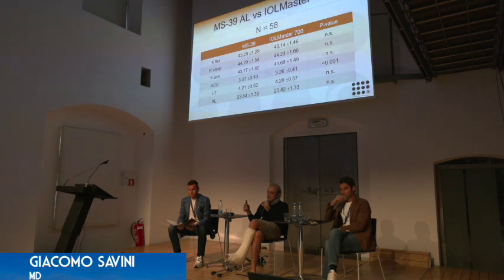And the difference for ACD is not surprising because we all know that there is a bias on the IOL Master 700 that is due to the original IOL Master.